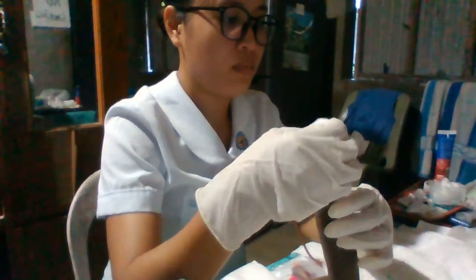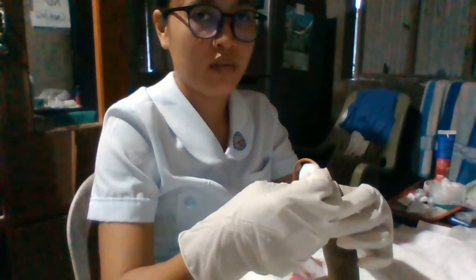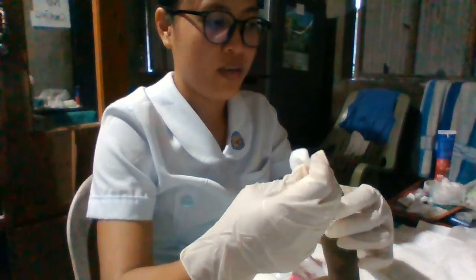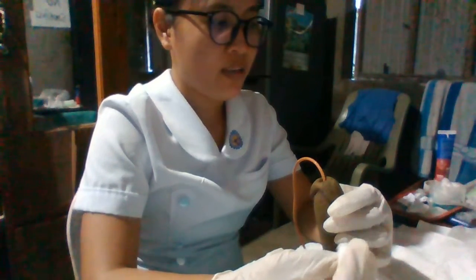Next, after wiping around the urethral meatus and the glans, reassess the urethral meatus for any discharge. If there is, we are going to note the color, odor, and amount.